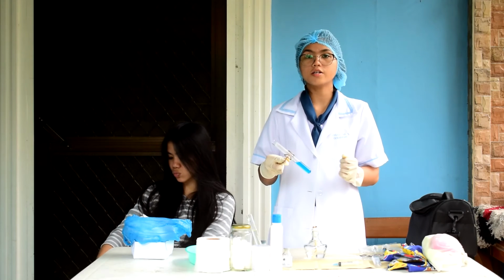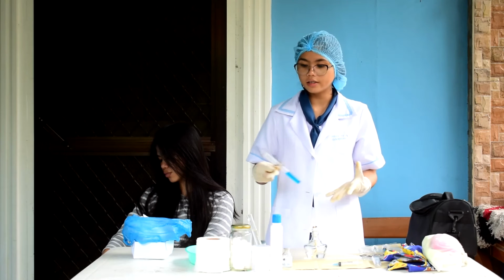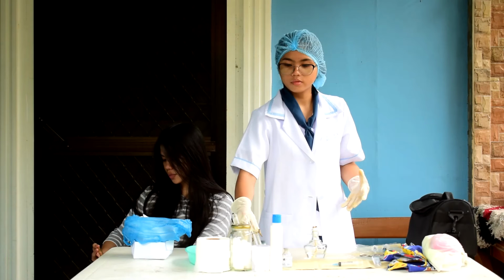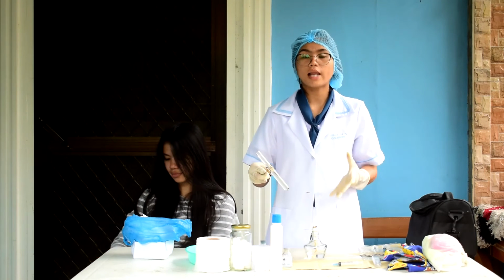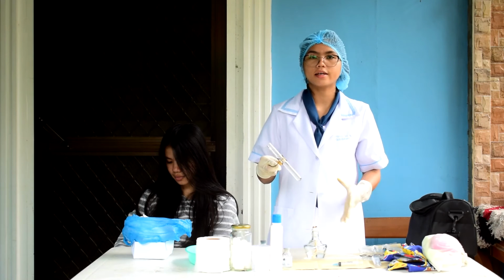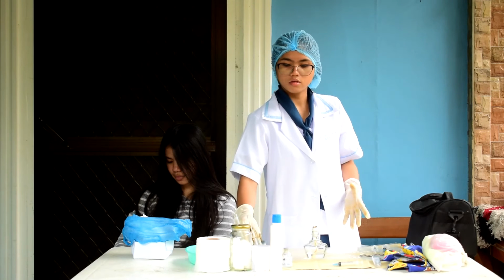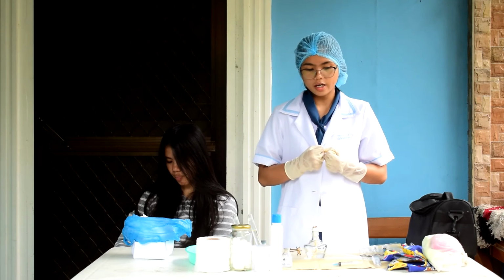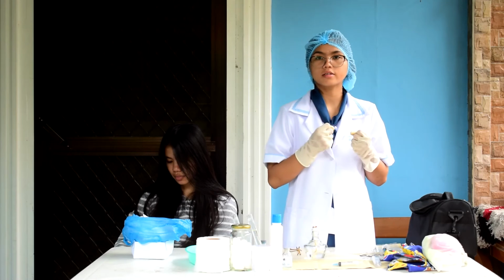So I see the result. It remains blue. So it means negative. And this one, there's no cloudiness and negative as well. So after that, clean all those materials and put some alcohol to disinfect the materials.